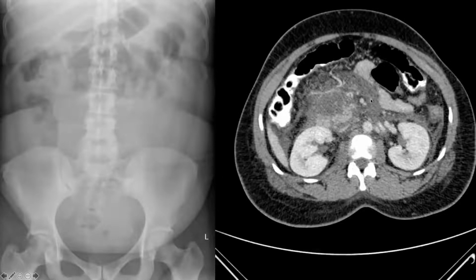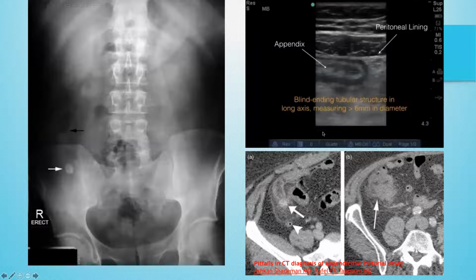And what's going on here, the patient has a sentinel loop because of an underlying necrotizing pancreatitis. So you see the pancreas, you see places of the pancreas that are enhancing normally, but there's a big portion of it that's grossly edematous and it's not enhancing. So this is classic. And there's a little bit of fluid here and a little bit of fluid there, a little bit of free fluid. So this is quite classic and it's a nice case. So this is a big one.